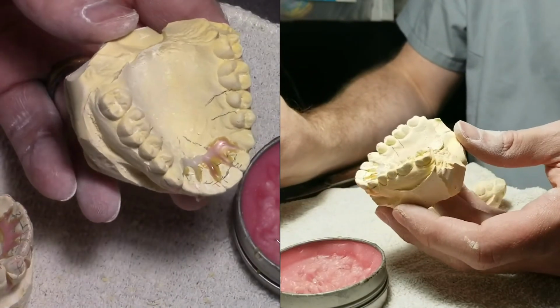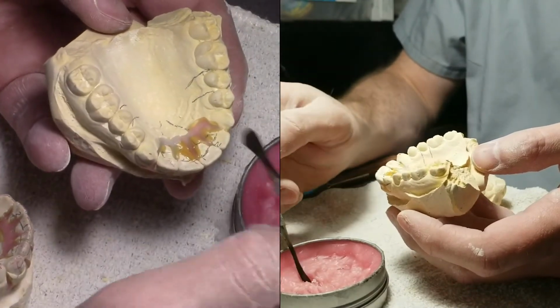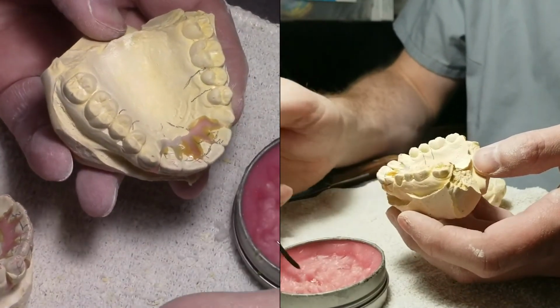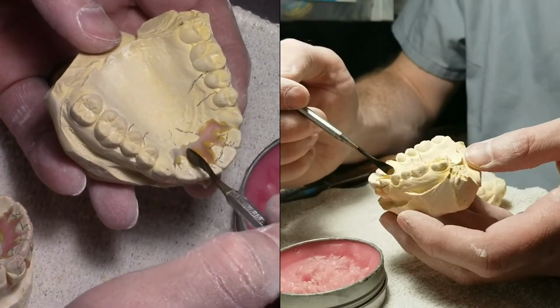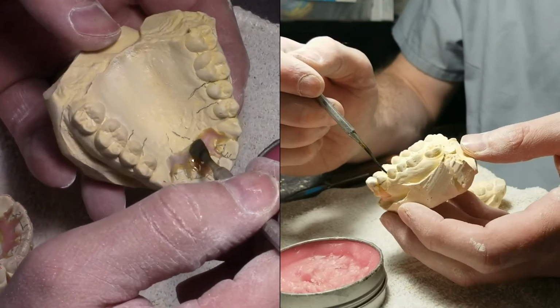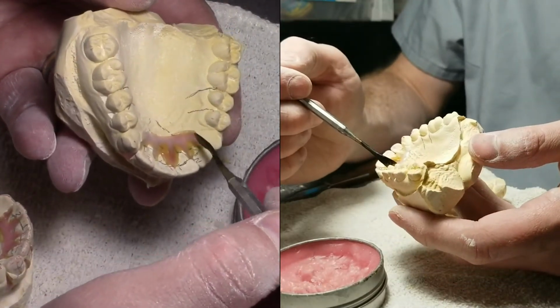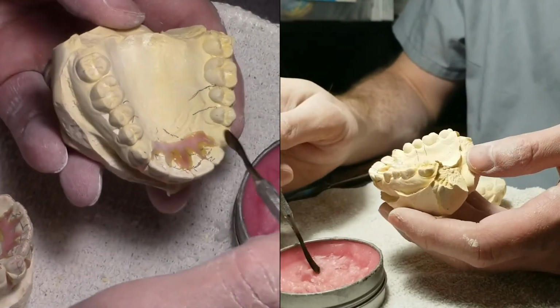But before, you remember I said something about the incisal papilla? You got to remember to build that back up. In other words, it's going to impinge. It's good to overbuild instead of underbuild, and then it impinges on their tissue. And when they go to wear it, it's not going to be very comfortable for them.